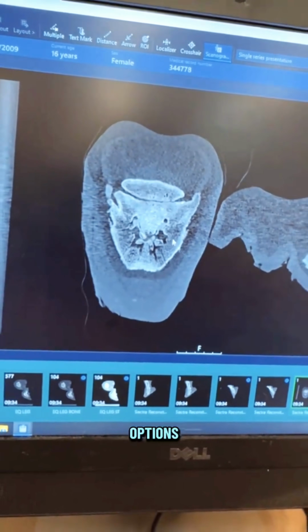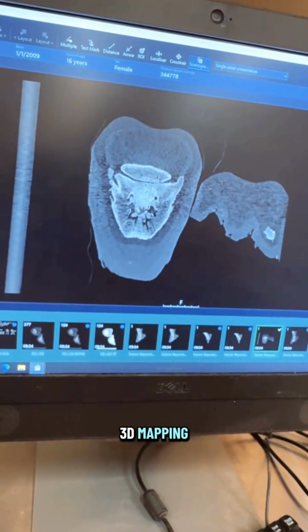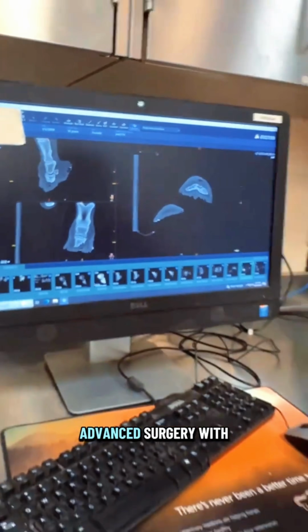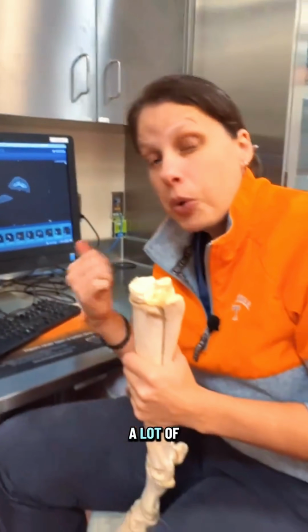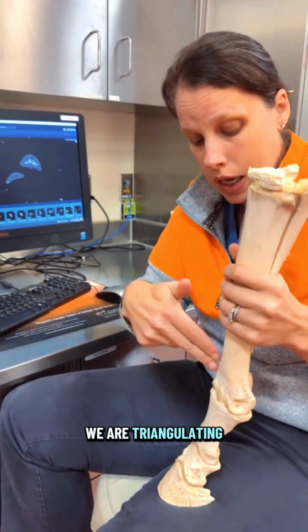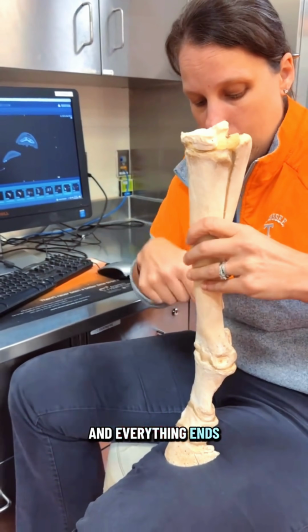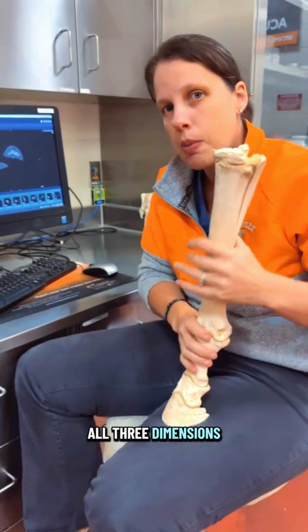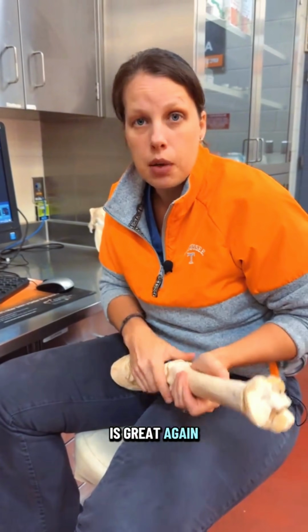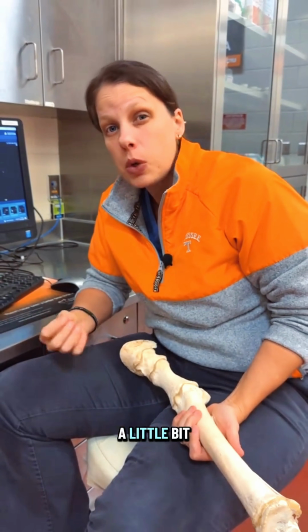There's just a few other options, again, of how we can reconstruct and actually get that 3D mapping. Anytime that you have a lot of advanced surgery with implants, a lot of it is CT guided. So if you talk about CT guided things, we are triangulating and making sure that those drills and those screws and everything ends up exactly in all 3 dimensions, perfectly straight. So CT is great, again, about bone things, x-rays, bone. What it's not great at is a little bit of soft tissue.